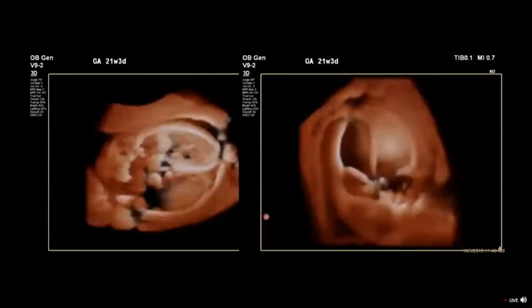And then we use the light. Here's a coronal image. This is that transfrontal coronal image. We put the light actually into the volume, shadowing the opposite side, because the interhemispheric fissure is definitely intact. You can actually see some of the thalamus preserved, but this is to demonstrate to her the baby's brain is severely damaged. And with 3D technology, I mean, patients understand the 2D, but they tend to understand the 3D better.